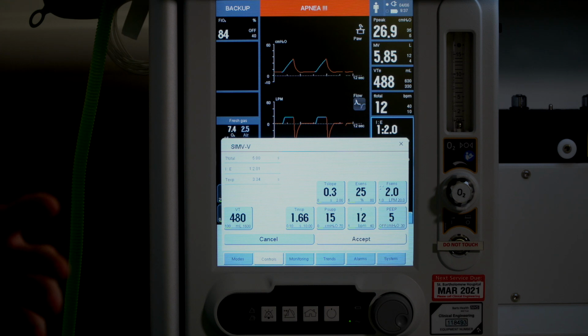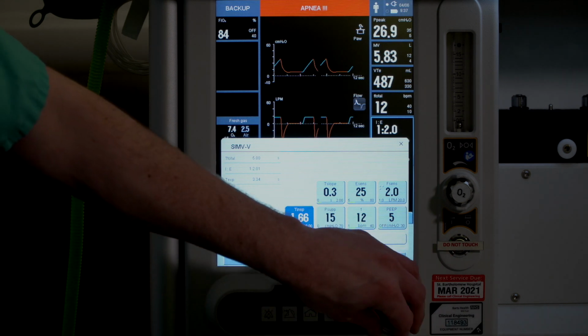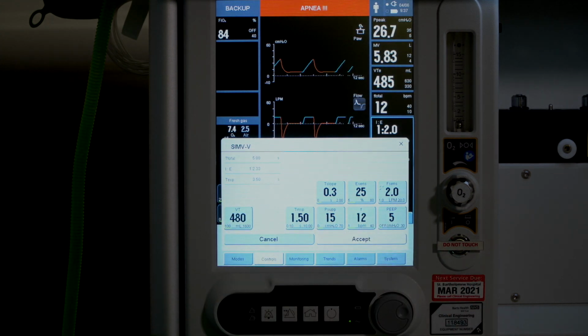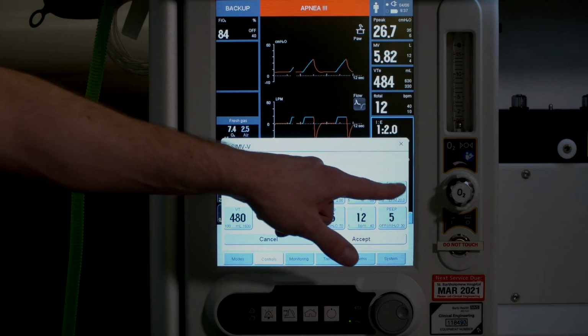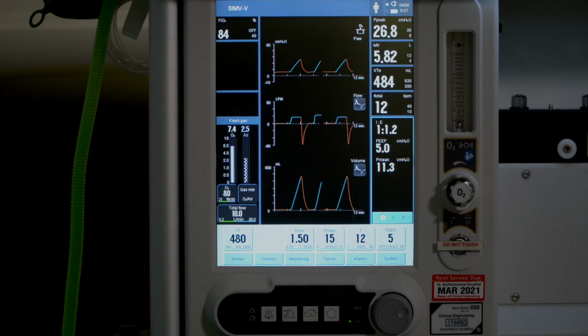You can breathe around that, but only when the machine is not giving you a mandatory breath, so in the expiratory portion. That's why you need to set the inspiratory time. We normally recommend somewhere between 1.4 and 1.6. The rest of these values are pretty simple, similar to what we've already set for pressure support, and we can see we can accept that.